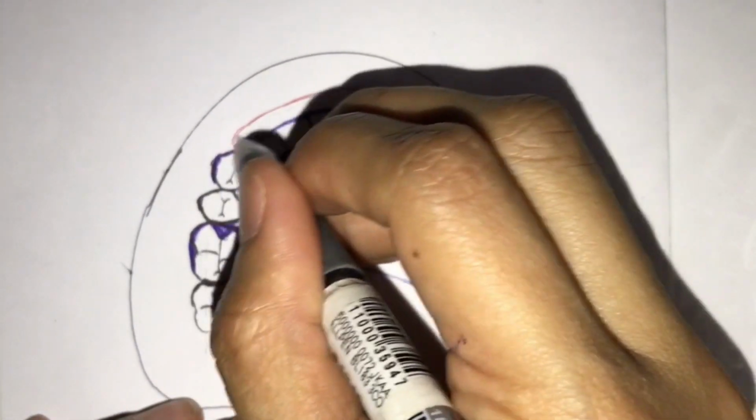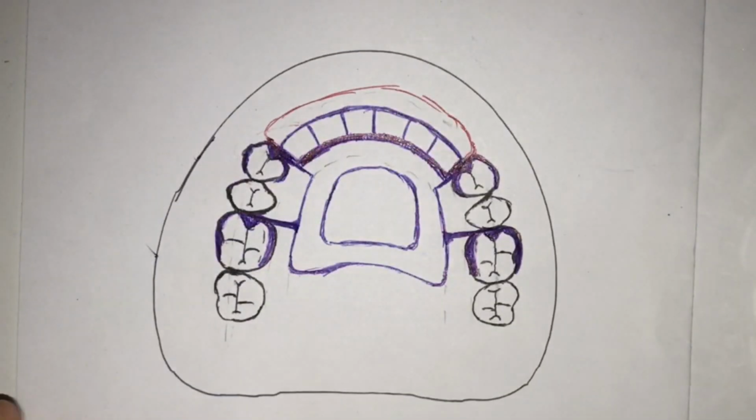Placing something underneath the denture base, knowing that your denture base is slightly translucent, it will have a shadowing grayish effect and it will not be aesthetically pleasing. If it's located more posteriorly, then maybe, or just maybe, we can consider using an I-bar coming from an anteriorly located edentulous area. Okay, nonetheless, this is one of the most basic.